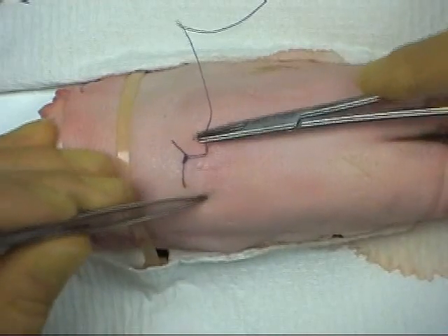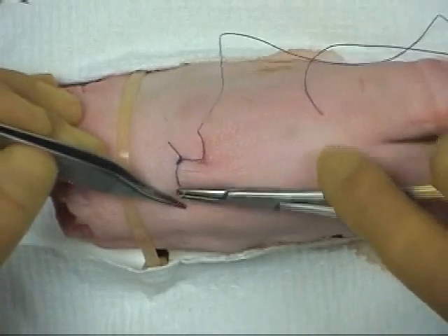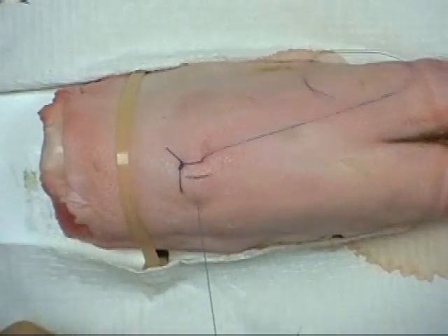The needle is again introduced at 90 degrees to the surface and driven along a curved path with counter pressure applied.